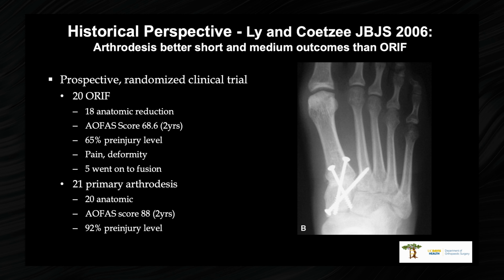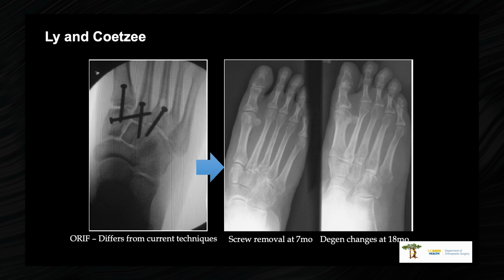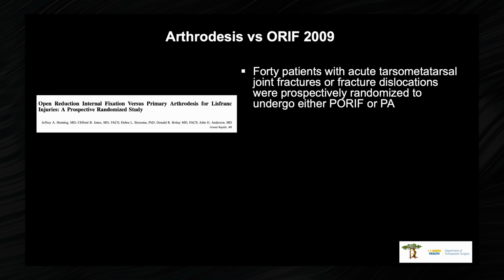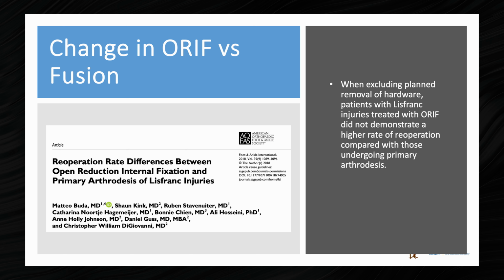Back then they were looking at, hey, ORIF versus fusion, but this was the ORIF. It was just shoving some synthes screws across it. All we had was large frag or small frag screws back then. And is this better? Well, no, because they probably all got arthritis. And so there's been a number of studies looking at percutaneous ORIF versus primary arthrodesis, and that there wasn't a huge difference. And then there's been a change in the literature over time. And if you exclude hardware removal, et cetera, there really weren't a higher rate of reoperation.